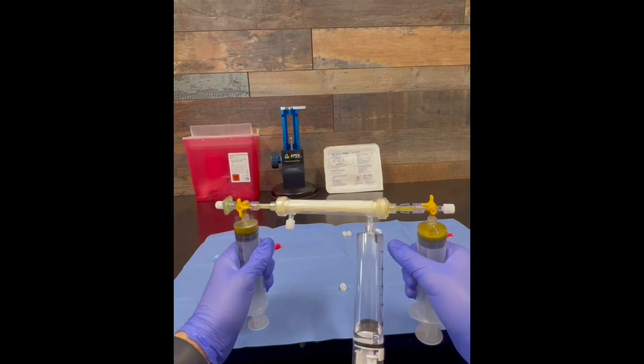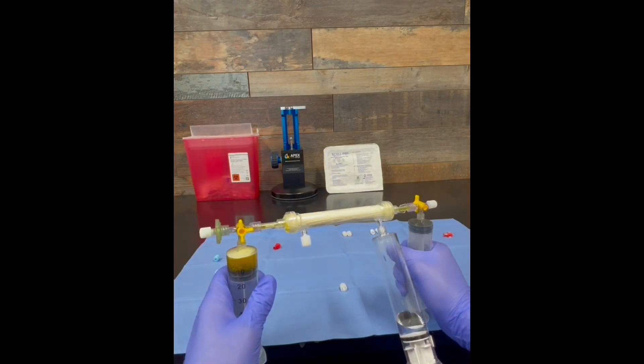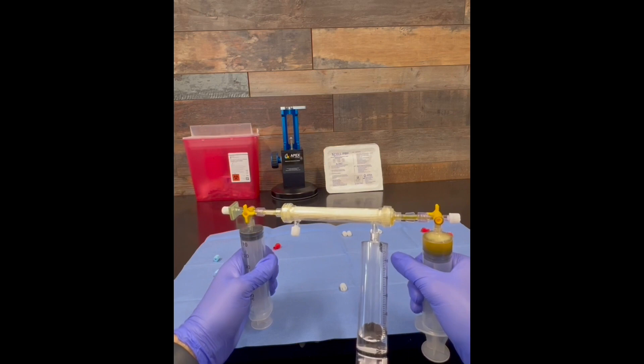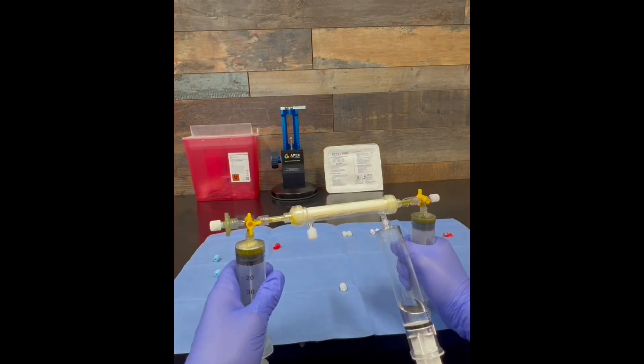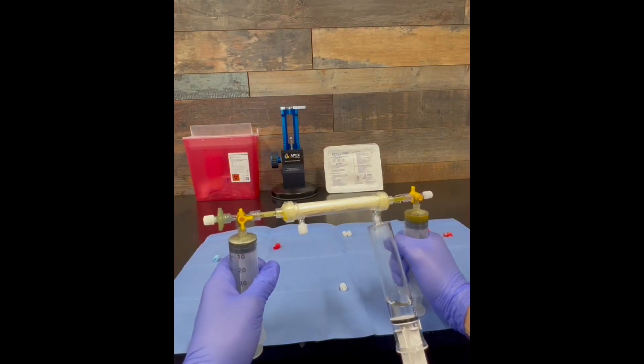Grab a hold of both 60 ml syringes and use the edge of a table or counter to alternate pushing the plungers of each syringe in, causing the platelet-poor plasma to pass back and forth through the main filter.